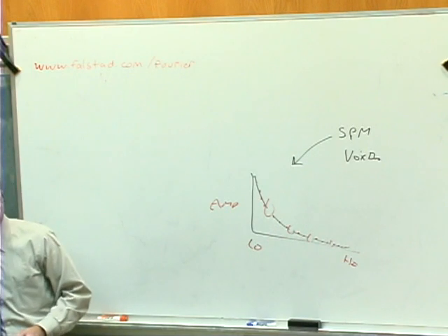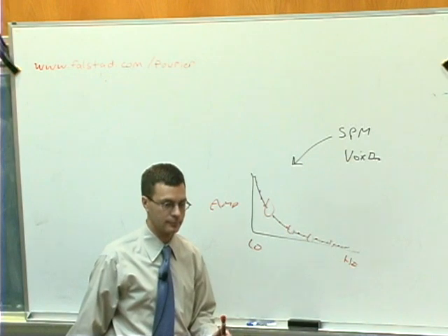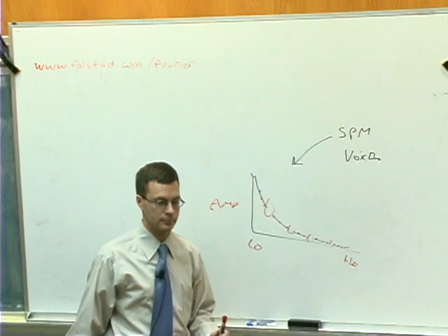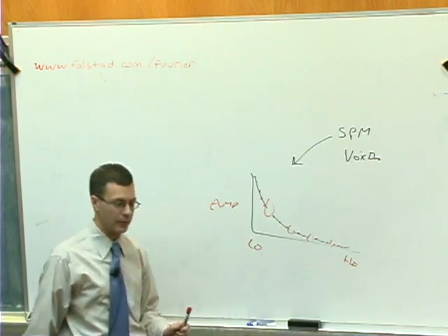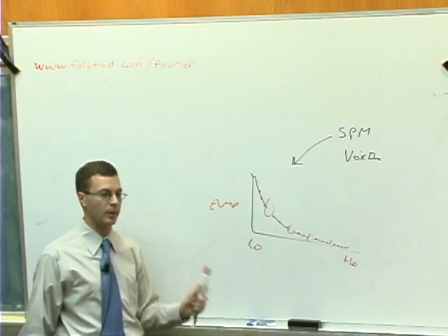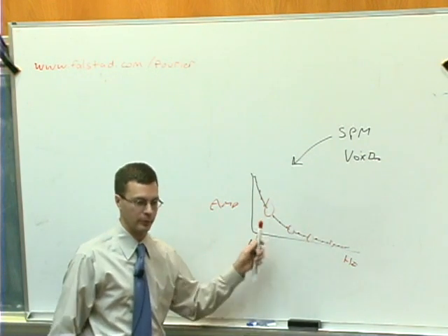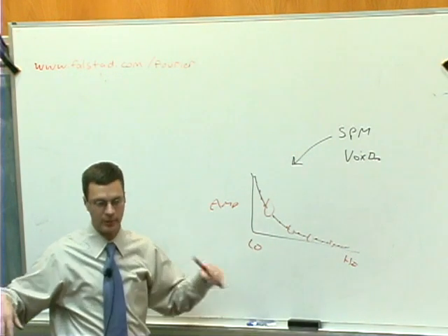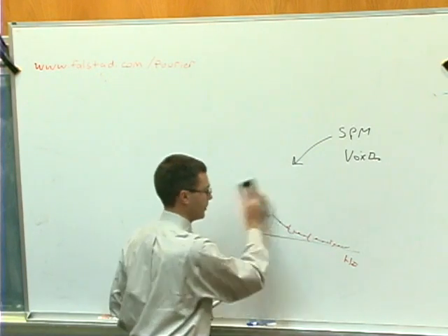Well, you would expect the fit would be different depending upon whether or not you mask out these frequencies or not. But is there any case where it would be better to not include it? Yeah, so the case in which it would be better not to include it, we'll come to in a moment, and those are experimental designs which don't have their power at just one or two frequencies, but instead have power at all frequencies. We're coming to that, and I'll be sure to make a point of reminding you of that when we get to it.